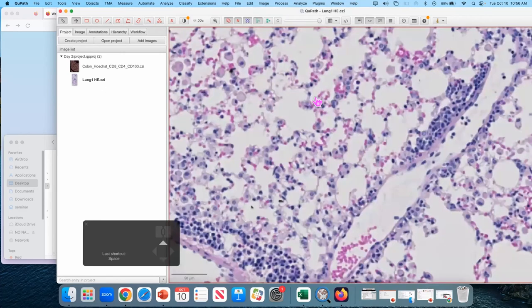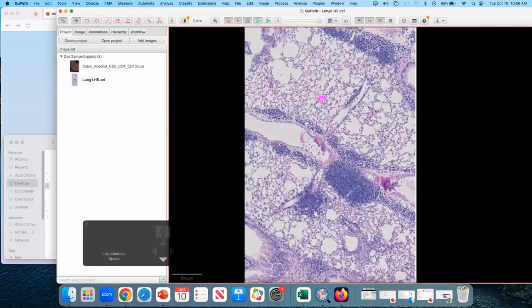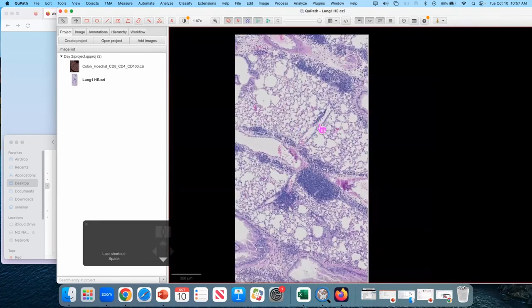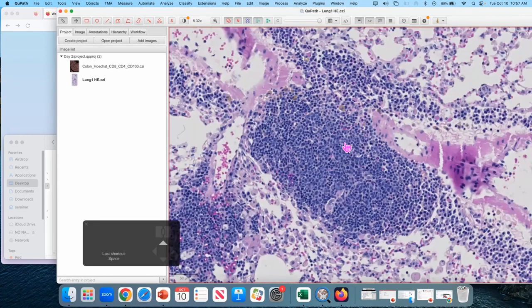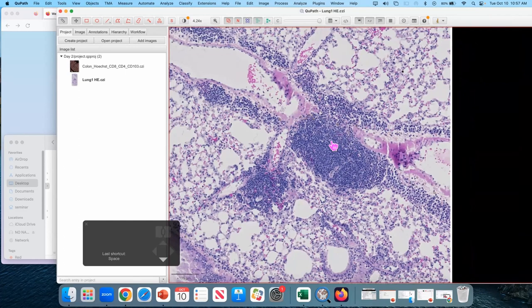First of all, it's lung. You can tell that by these alveoli and the net-like alveolar interstitium, or these capillaries at which air exchange happens. I would guess this is from a mouse based on the scale of it. That would make this what's called an inducible BALT, bronchus and bronchial-associated lymphoid tissue. Humans have a resting BALT. There's BALT there in the resting state. In mice, it's inducible. So this is obviously a blood vessel here.